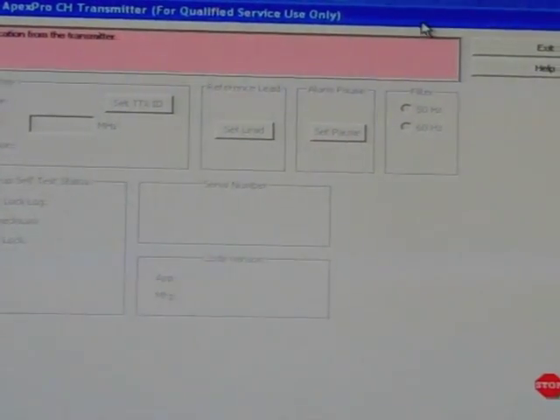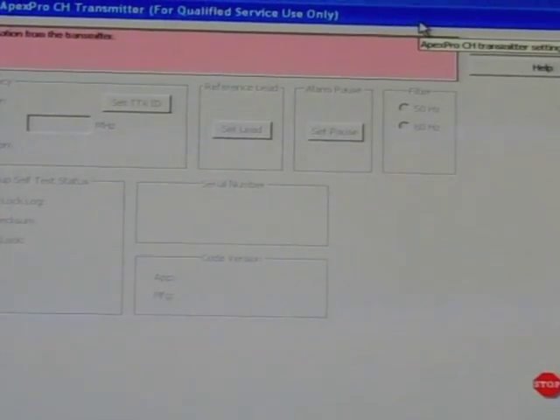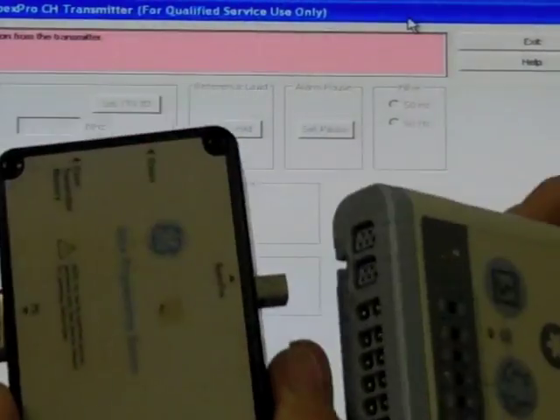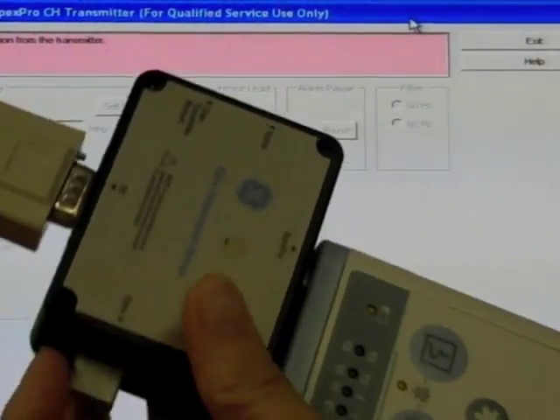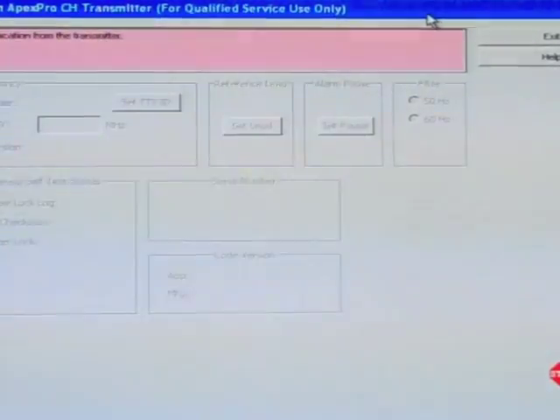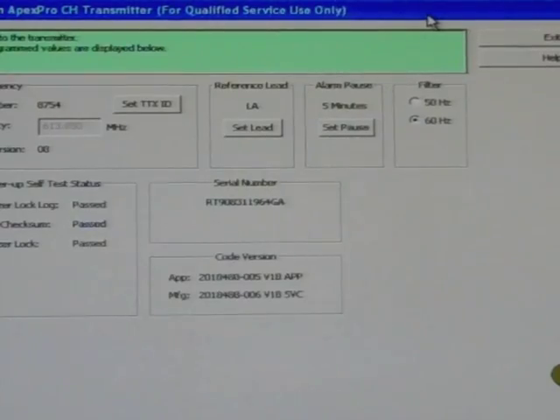This is the programming screen that will pop up after you've clicked on your patient. So you'll put the batteries in your transmitter, hook your transmitter into your box through the port on top, and at this point you'll see the lights start to flash on your transmitter. That means they are talking. So we'll let them talk, and shortly thereafter you're going to see your information pop up on your info screen here.